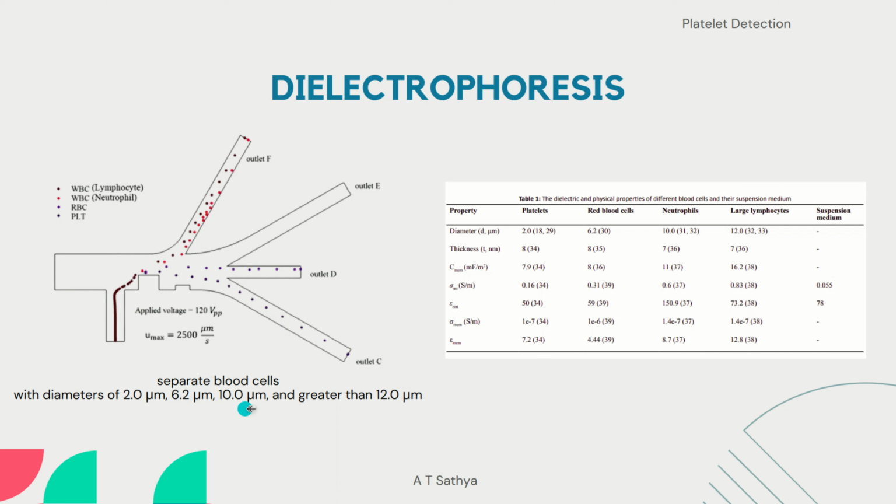A major disadvantage of this method is the difficulty in distinguishing the large platelet cells from extremely fragmented red cells, fragmented WBCs, and other similar sized particles. So this may result in a false increase in the report of platelet count, and this difficulty is due to the discriminator used based on the size to segregate the platelets from RBCs.